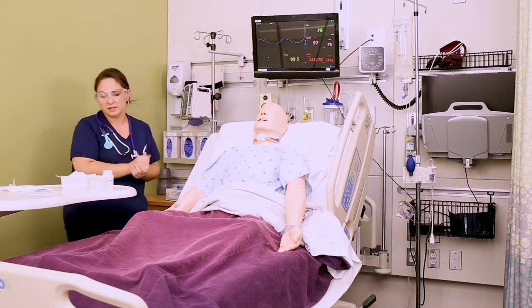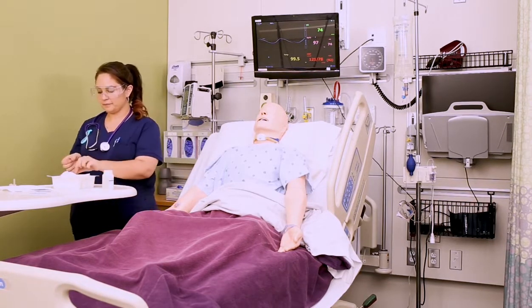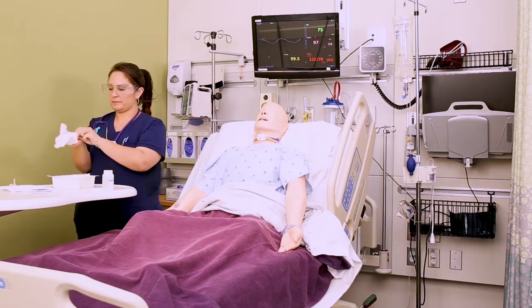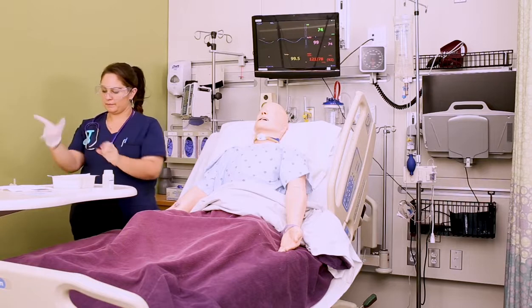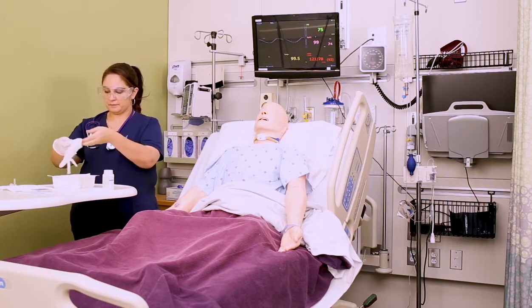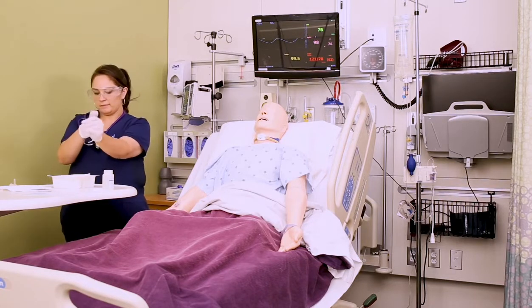Now you can grab the sterile glove pack from the kit and put on your sterile gloves. Again, go to the sterile gloves video here if you need help or need some review on how to put on sterile gloves. Throughout this entire procedure, you want to keep your dominant hand sterile.